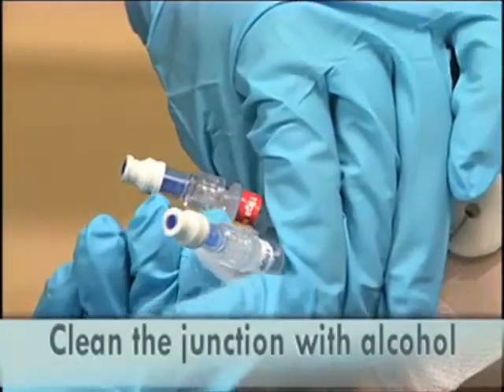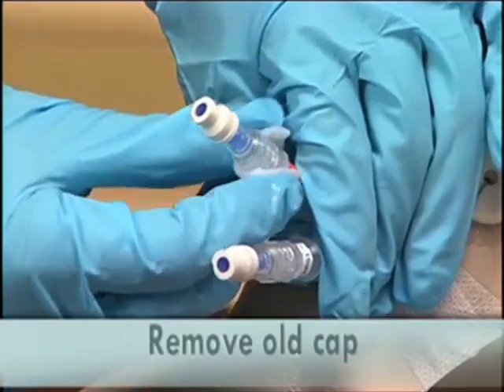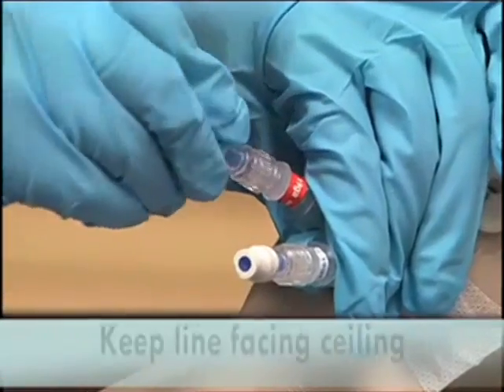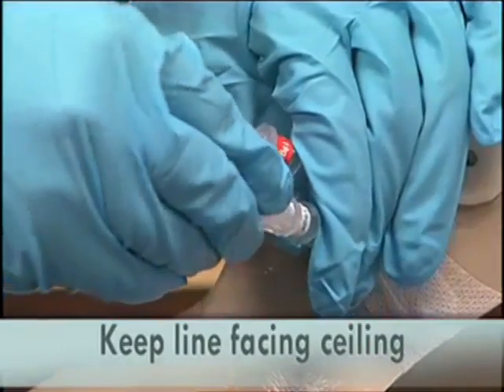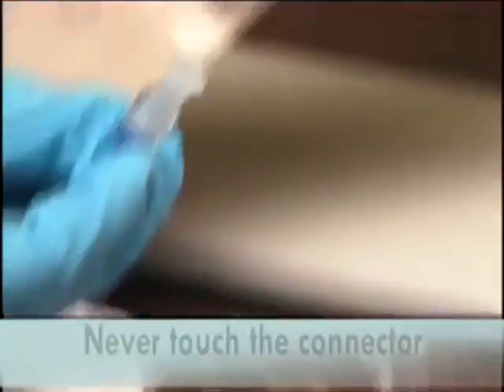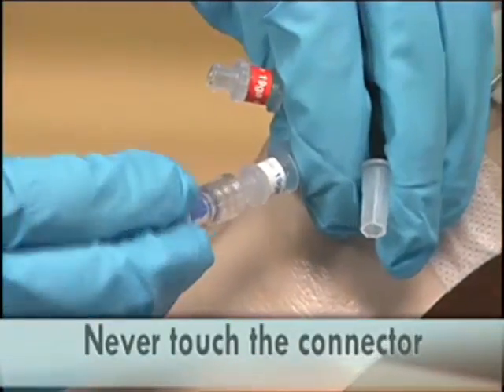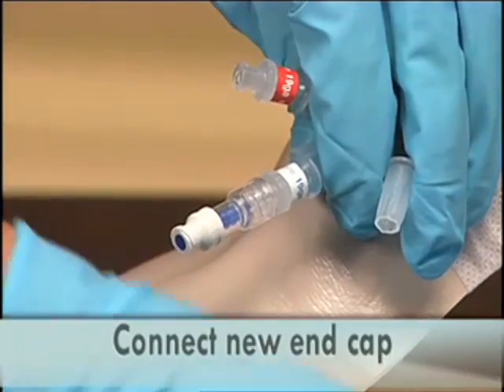Wipe the junction of the cap and line with an alcohol wipe. Remove the old cap and set aside. Keep the line facing toward the ceiling at all times. This prevents the possibility of contamination. Never touch the connector or the inside of the cap. Connect the new end cap securely.